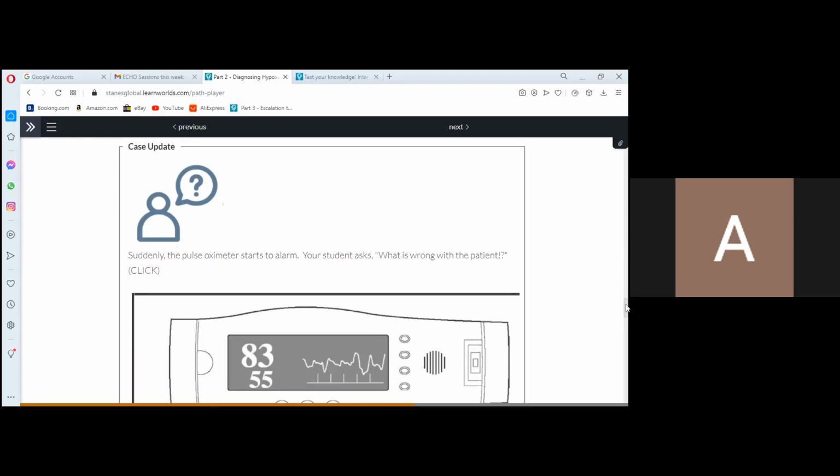Okay, if the oxygen saturation is below 90%, when the SpO2 is below the normal range, excellent. Low SpO2. Movement, drop in oxygen saturation, use of diathermy, drop in pulse rate, yes, there is some disruption, excellent.